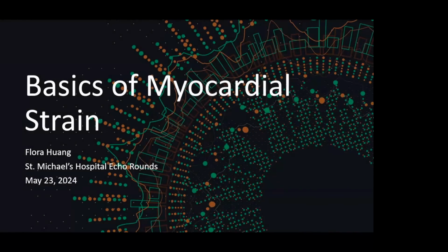Thanks for joining today. I'm Flora, one of the Echo Fellows at St. Mike's. And today I'm going to be talking about the basics of myocardial strain.